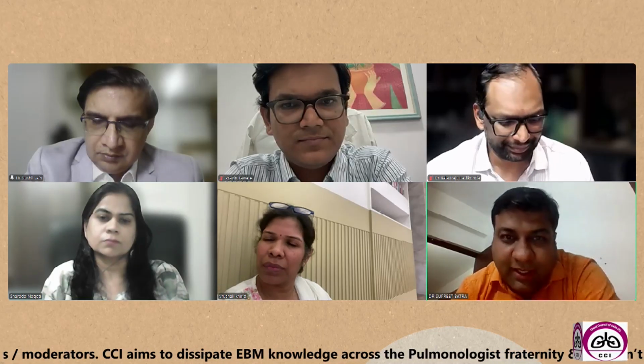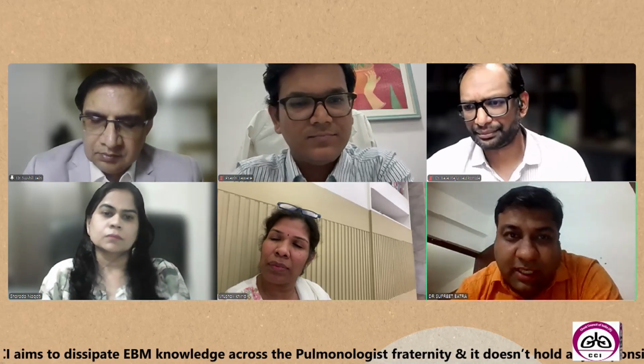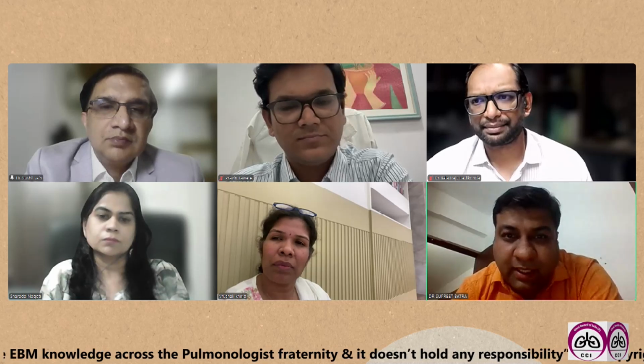And I just wanted to comment on the previous things. The PET CT, the first question, it also shows us the other extra sites where the tumor can spread. That is one thing. And as Dr.